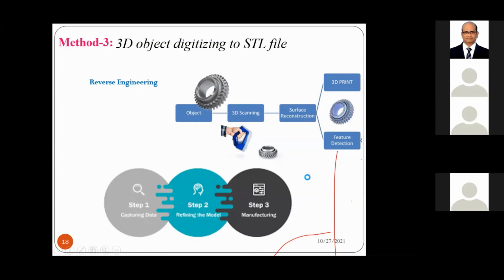Is it clear about this CURA software? Do you have any doubts in this one?